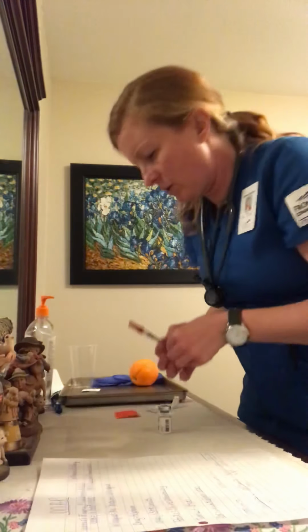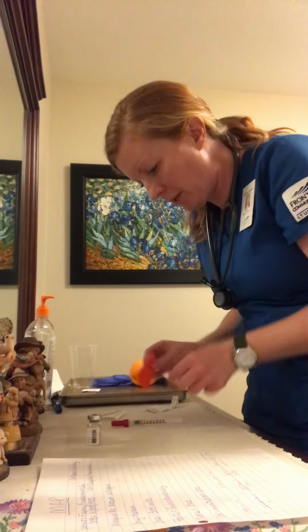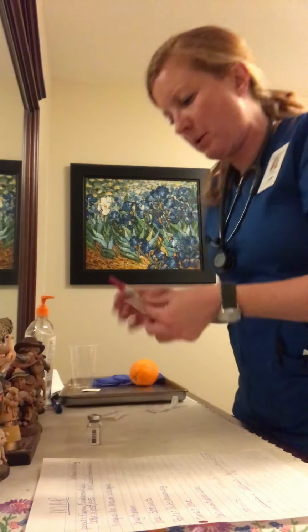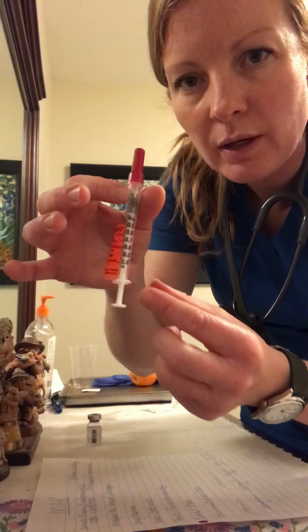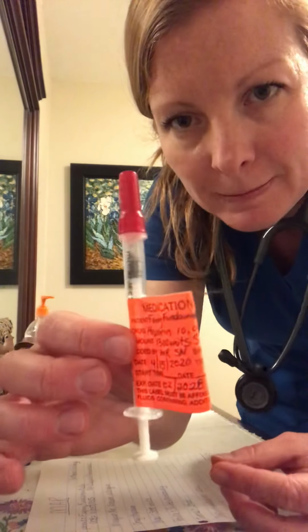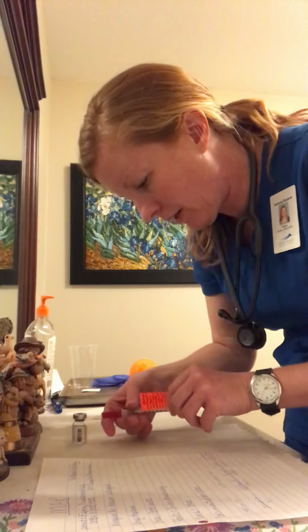So there is my syringe. So we are going to be putting the medication label on it. I will make sure that it's not on any of the numbers, so it doesn't cover up any information that we need to see, and I'll fold it back on itself. Okay, so we have our label, not on anything, and you can see the 0.13. There's that. So now we are going to perform our second six rights. So I have Fanny Fundamentals.